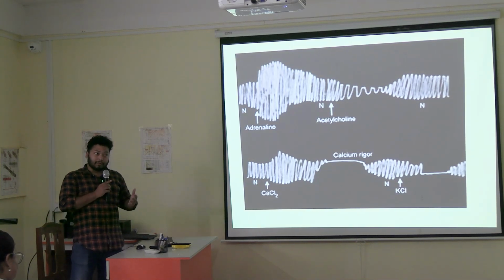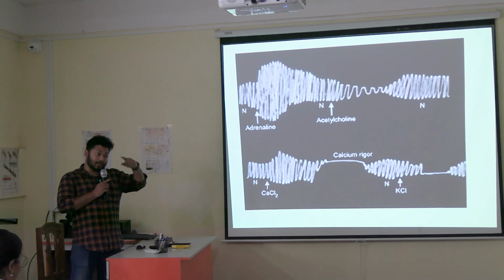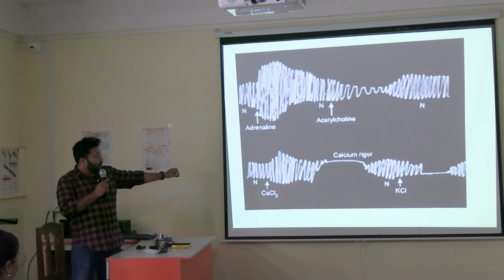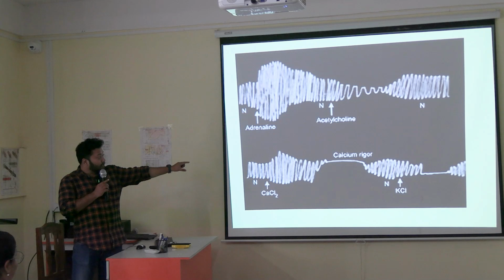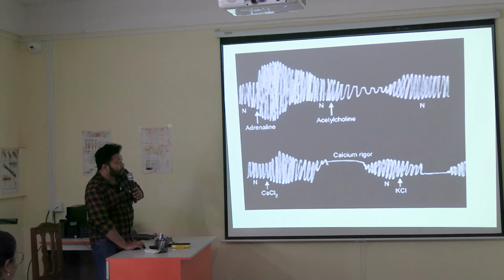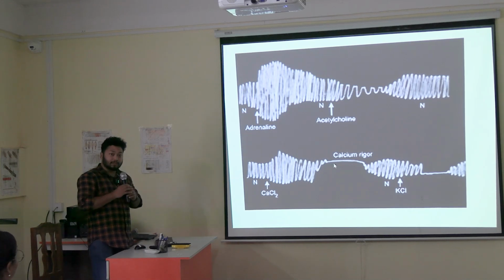This is the same as before, but in this condition, what happens when we introduce calcium chloride? You all know from the previous experiments that when calcium is more, fatigue occurs. When the calcium is already in the sarcoplasm, it's not able to relax properly, which is why the contraction remains and increases. So when calcium is provided, you can see the wave disappeared from the above part, which means it was about to go into systole. What is systole? It is the contraction of the heart.